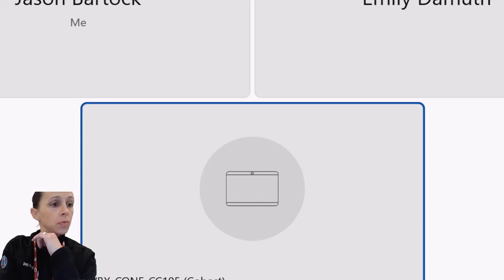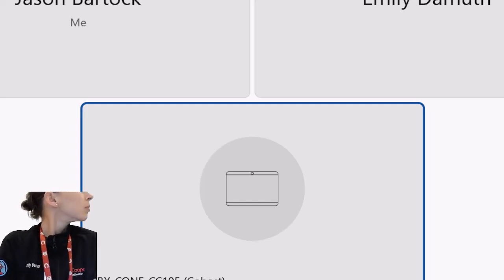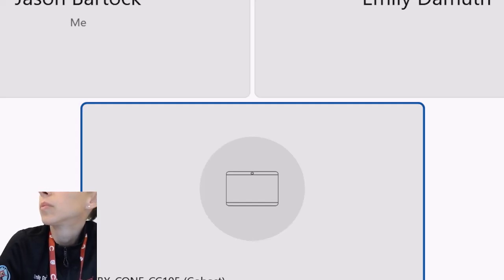Is a circuit change done at the bedside versus going to the OR? Yeah, all circuit changes will be done at the bedside. Some cannulas might be removed in the OR. Most of even our repositioning of VV cannulas is just bedside too. The VA stuff tends to happen more in the OR.